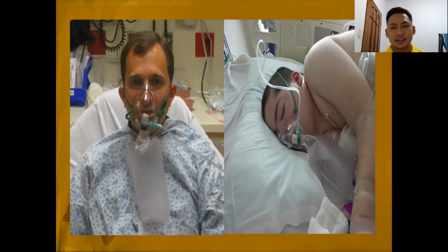Okay? Remember, you also have to look at the reservoir bag of the patient. When the patient inspires or inhales, the reservoir bag should not be fully deflated. Okay? Some air should be left.